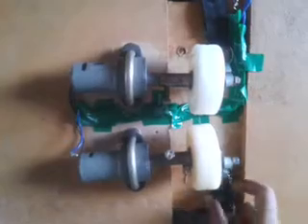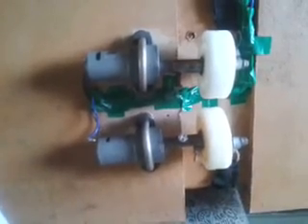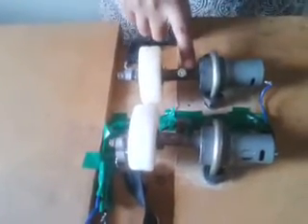It will utilize a battery operated motor and driveshaft apparatus that will connect the belt with the board in order to generate the forces necessary to shorten the load distributing band. The driveshaft will feed the belt into the board via an opening on the side. The motor and the driveshaft will pull the belt and allow the load distributing band to compress and decompress. The main component of the design is the board.